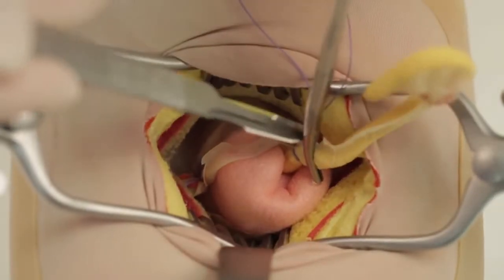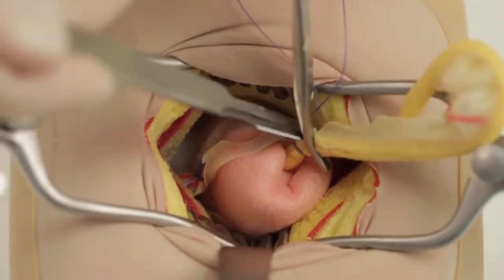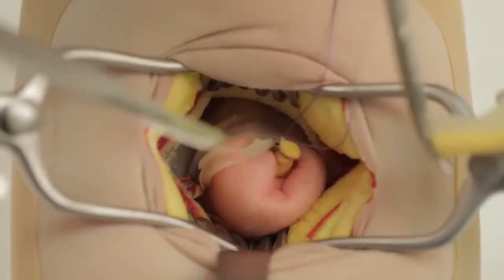Divide the appendix just proximal to the hemostat and place these instruments in a dish for contaminated articles.